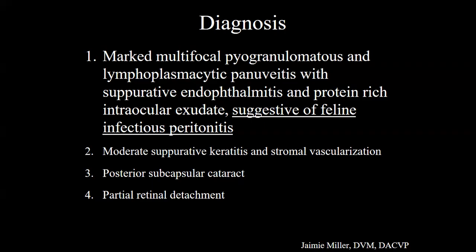But for what it's worth, the only times that I've really seen vasculitis in FIP cases is in retinal vessels, on very rare occasions. But that was not present in this case. The paper that was published, I forgot the specific name of the paper, and I forgot everything about it minus the fact that they described positivity being in macrophages almost exclusively, and they proposed that the macrophages with the antigens were coming from elsewhere.